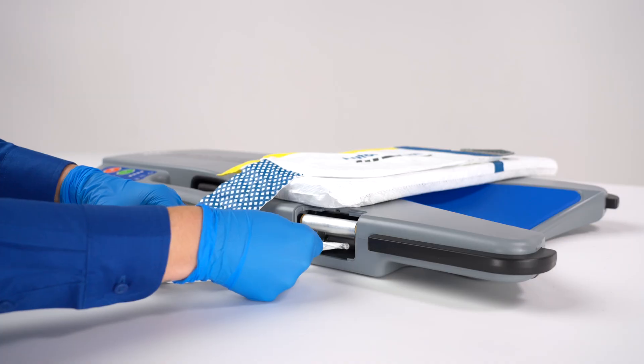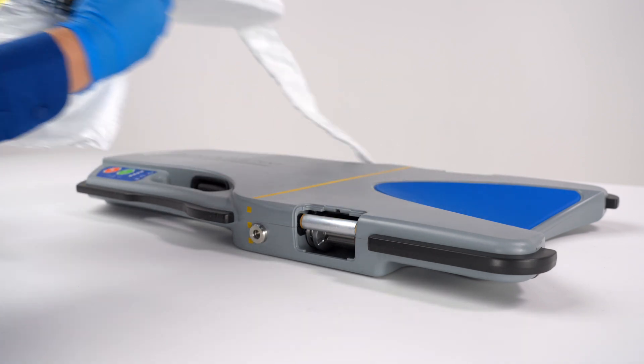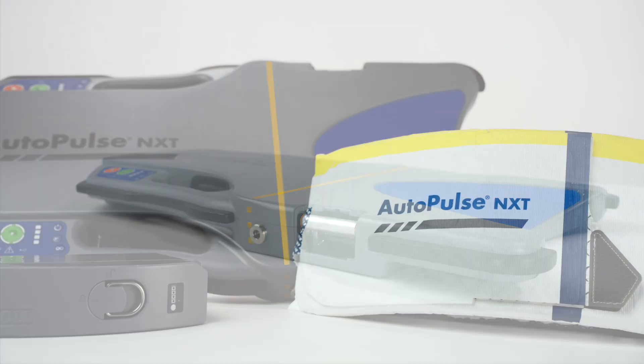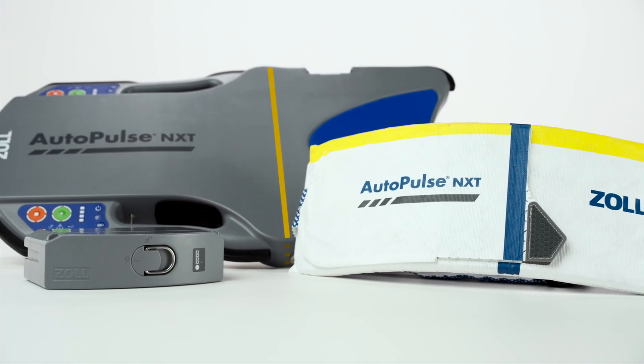Pull on the band to remove it from the platform. Repeat these steps on the other side. Discard the band as biohazard waste. We have now reviewed how to install and remove the AutoPulse NXT band.